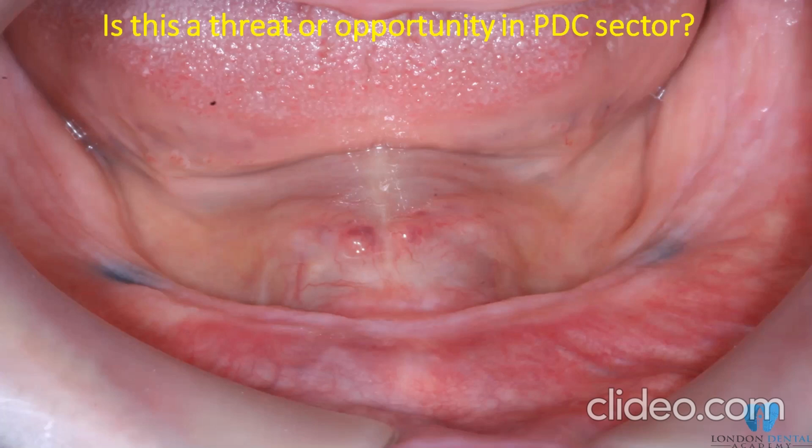And when we look at the denture, you'll find some ulcers in these areas. We've been doing this for over 20 years, and this is quite common, and I think most of you would agree that we need retention, but we do not need to lock the dentures in these undercuts if we can. So one area is enough. The green stick has to be hot to a certain extent, put it in some warm water, get it in, but you need to push the tongue away.